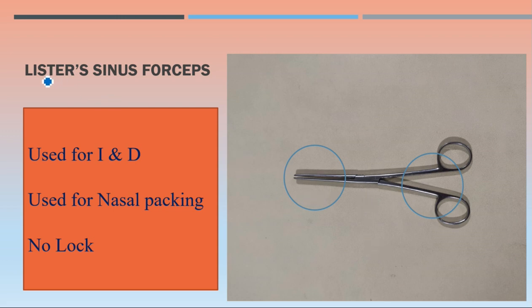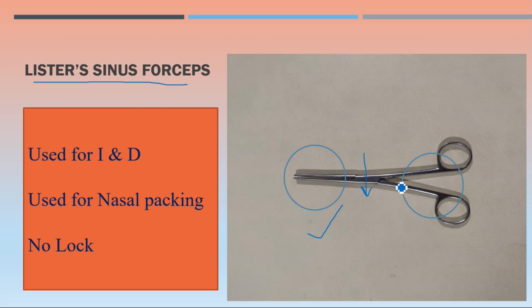The next important instrument is the Lister sinus forceps. Always pay attention to the name: Lister sinus forceps. Focus on the tip — you can see a long slender tip along with small serrations, the joint is visible, and importantly there is no lock here.